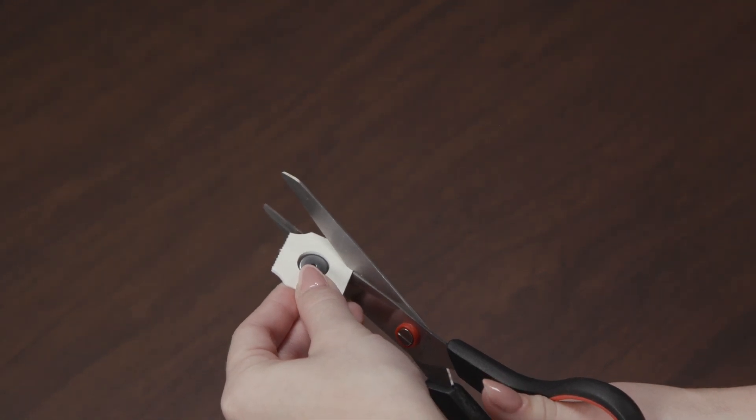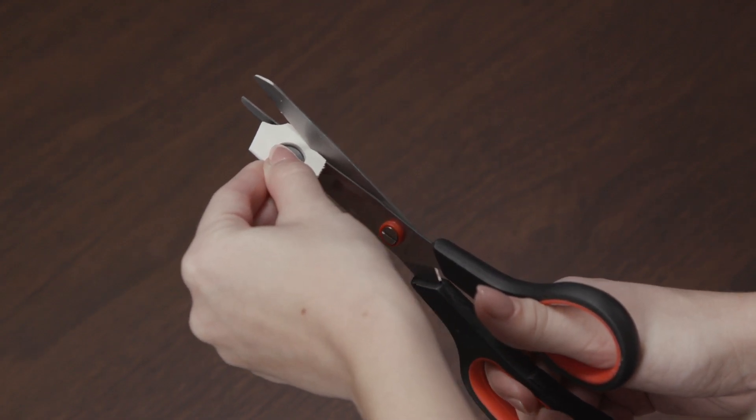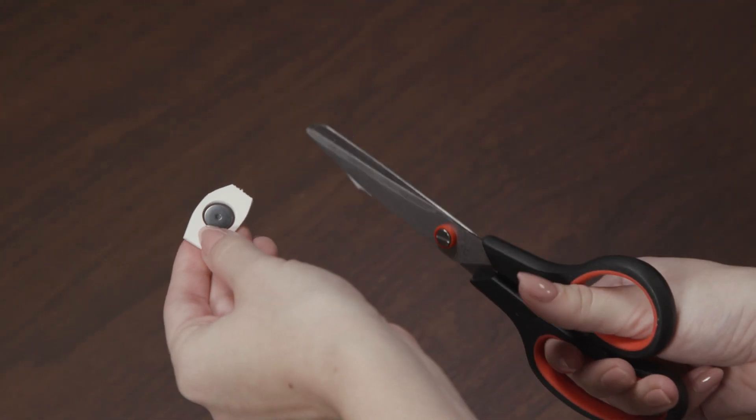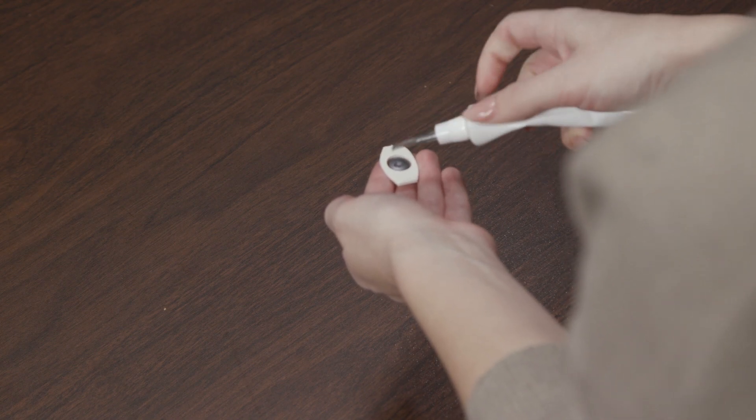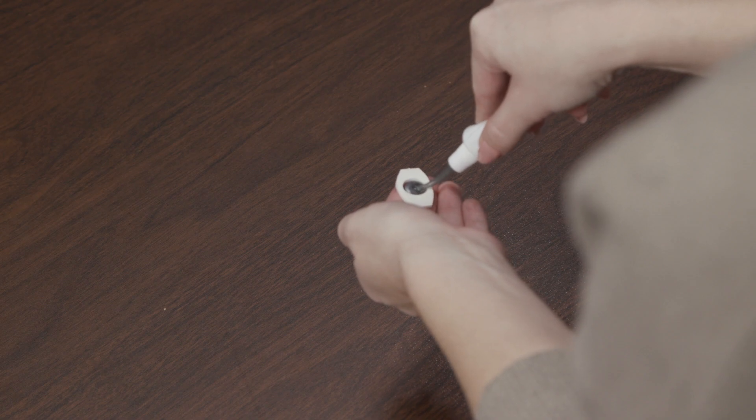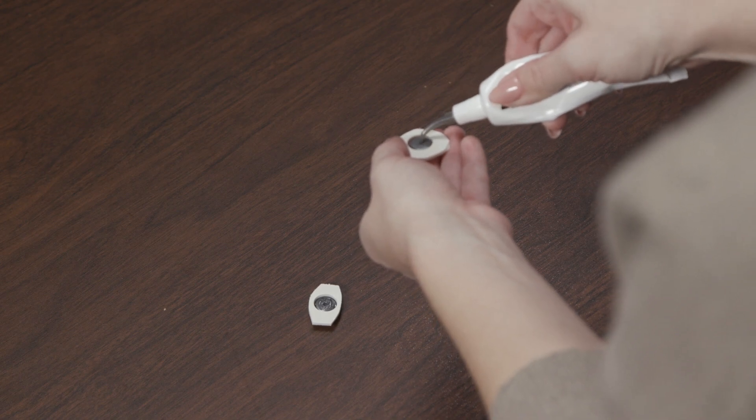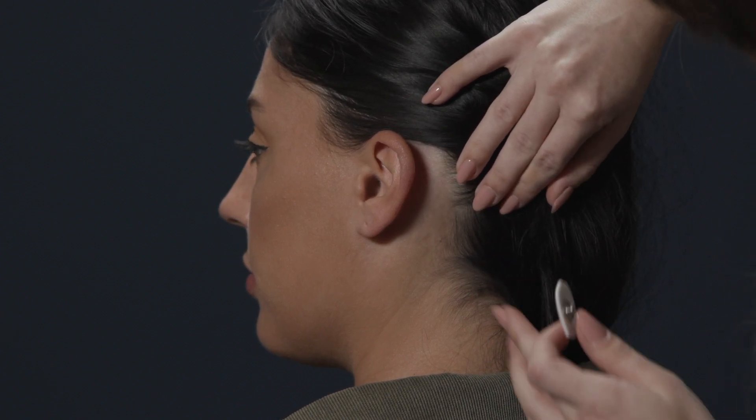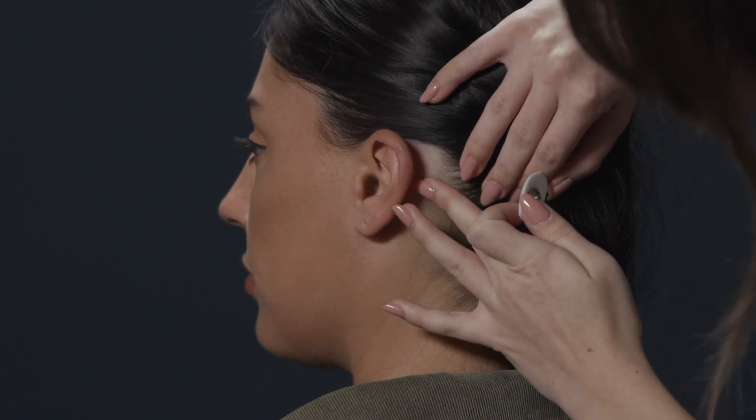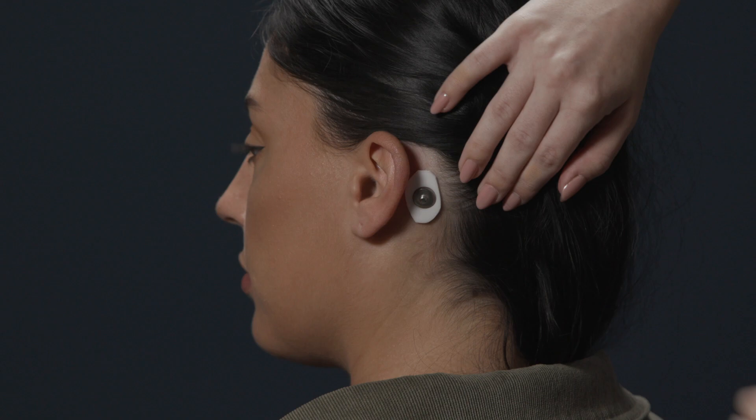Next, apply electrodes to the mastoids or A1, A2 sites. For easier placement and improved subject comfort, use scissors to cut down the size of the two adhesive electrodes. It is recommended to prepare these in advance and have them ready before the subject arrives. Apply a small dab of cream on the center of the electrode. Spread it out evenly. Peel the paper backing off the electrode to expose the adhesive. Then apply the electrodes to both mastoid sites. Avoid getting any of the cream on the adhesive area. Proper placement is critical, so take care to feel for the bony area behind the ear. Avoid the hair and muscle for optimal data quality and comfort. Be careful not to place the electrodes too close to where the strap will sit or right up against the ear.